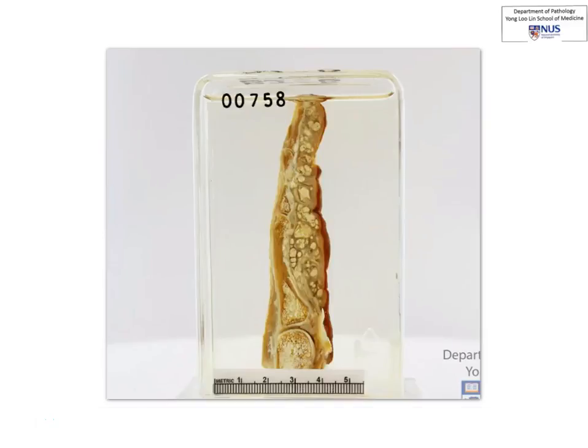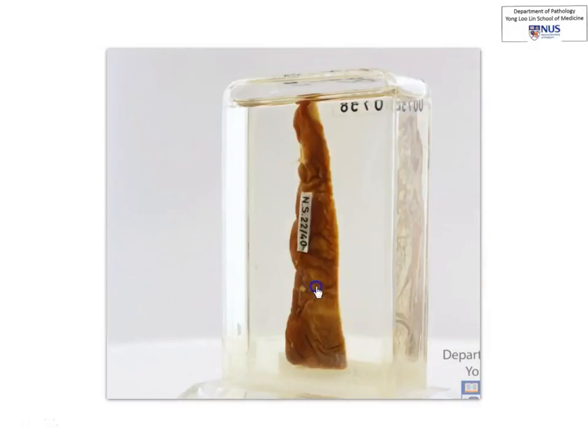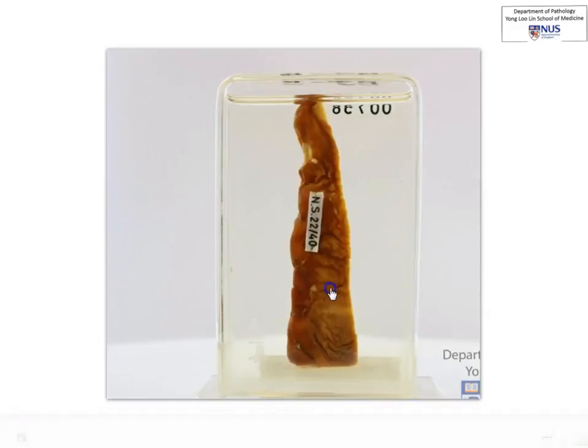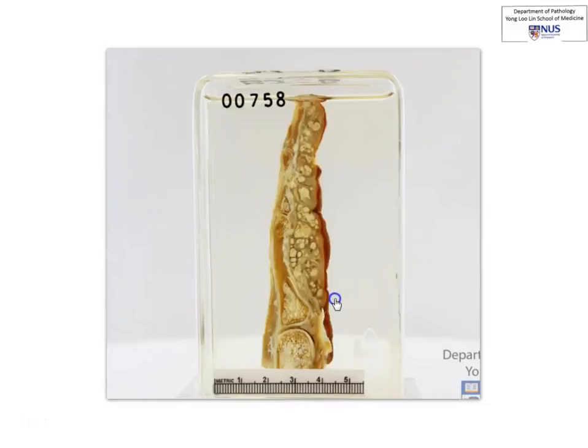Here is a virtual pathology specimen showing a finger which is cut in longitudinal section. I'm just going to rotate it for you to show you the skin surface here. You can see the fingernail on top. And then here we come back to the cut surface.